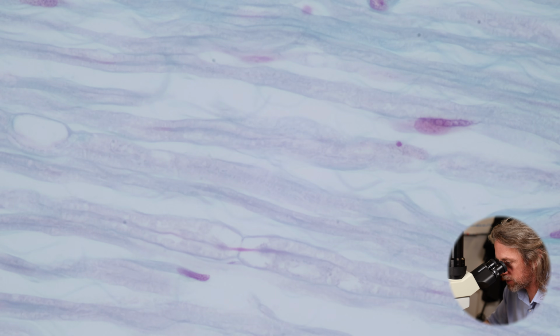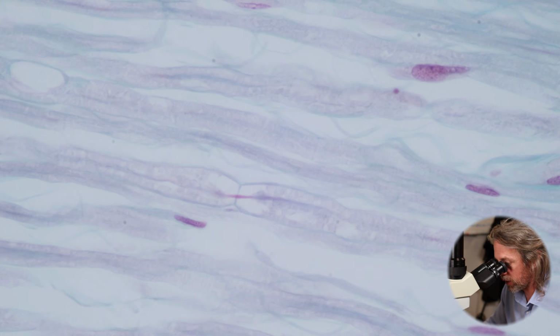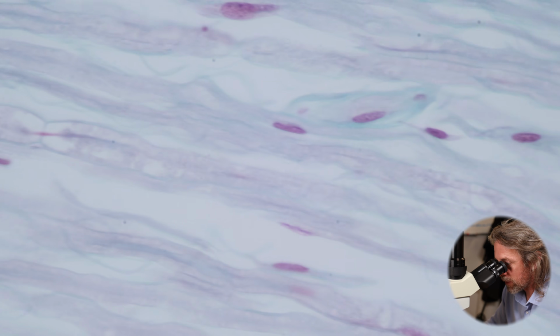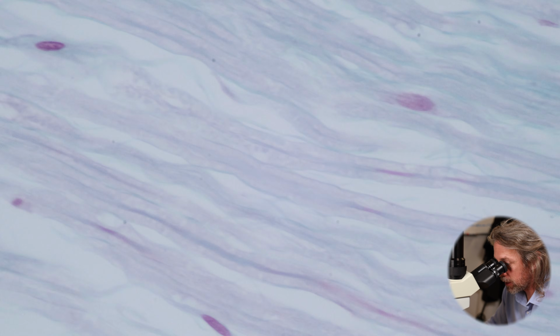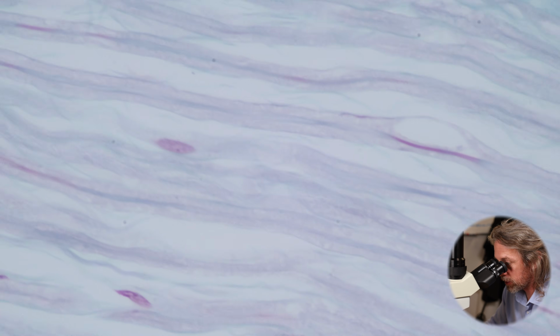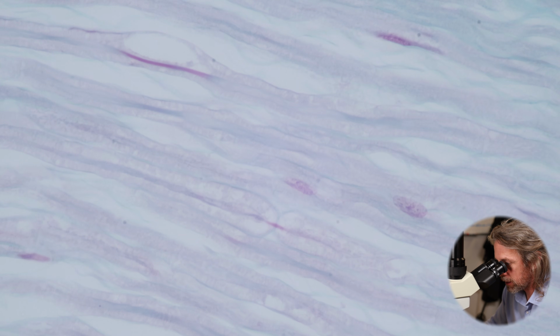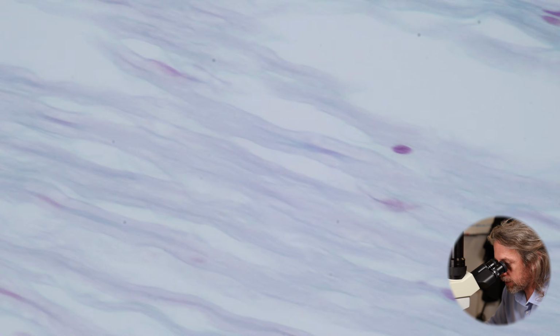Are you getting a sense of how you've got all these individual cells bundled together, they're all running along next to each other, they're all conveying action potentials, they're all surrounded by Schwann cells. By the way, some neurons are not surrounded by Schwann cells. We just are paying attention to the ones that are. And then you've got that endoneurium, that little bit of connective tissue running around them. But that's your peripheral nerve. There's another node of Ranvier. But very, very cool.